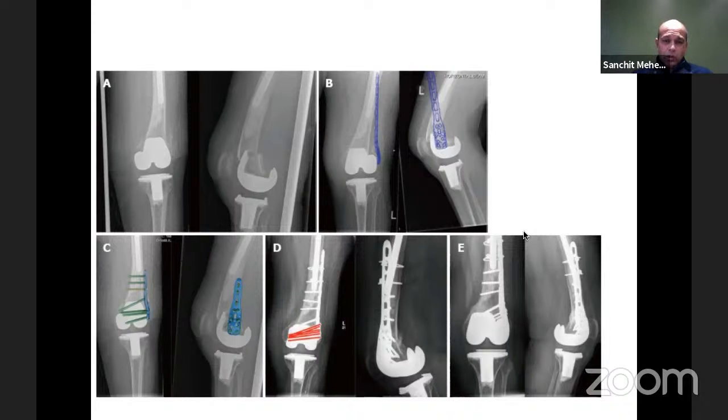And it's quite a good thing in areas, again, where there's been a big stress riser. So you've got a long stem proximally, you've got a knee replacement, and you need to get lots of screws in a small, tiny area. I think the modern stems and the modern plating systems are very good, and they will allow you plenty of screw options. They're either staggered or there are flange plates that go out that will allow you to change your angle of fixation.